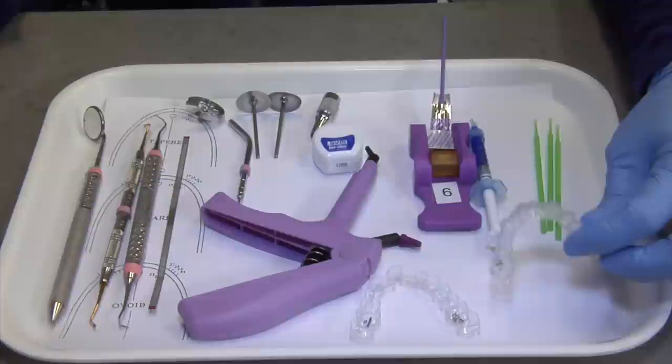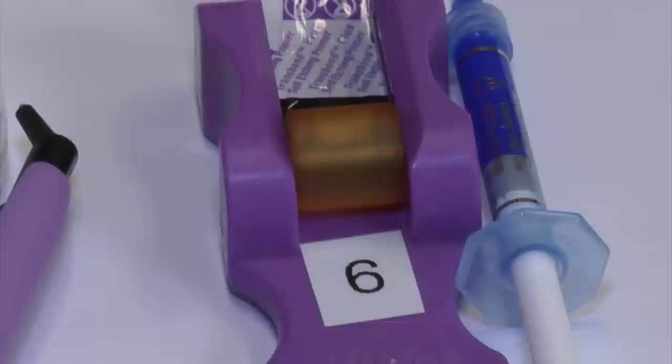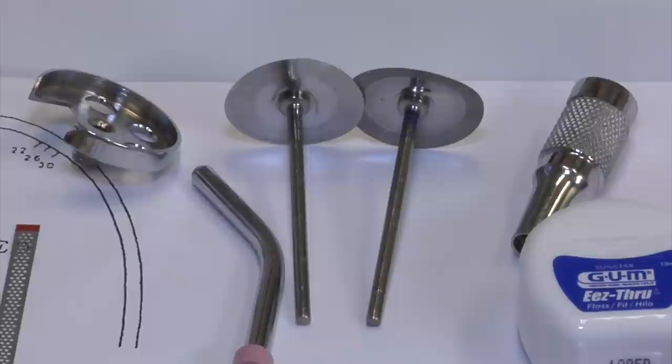These are the items required for the initial Invisalign appointment. We have the patient's templates, very similar to the aligners they will be starting today. We're going to be using some etch on the teeth — there are no needles involved. We're going to use a one-step primer and our special tetric glue. Dr. Van Nittalli will also be doing some interproximal reduction slightly in between the teeth.